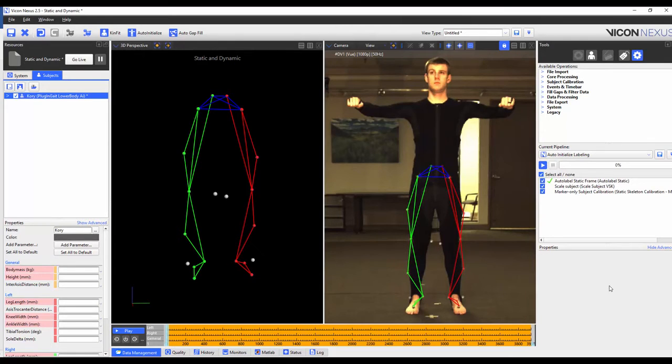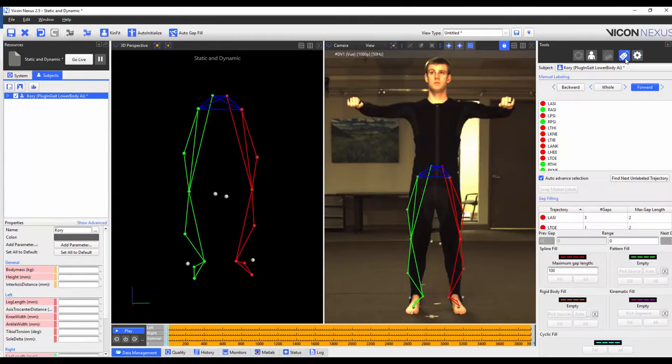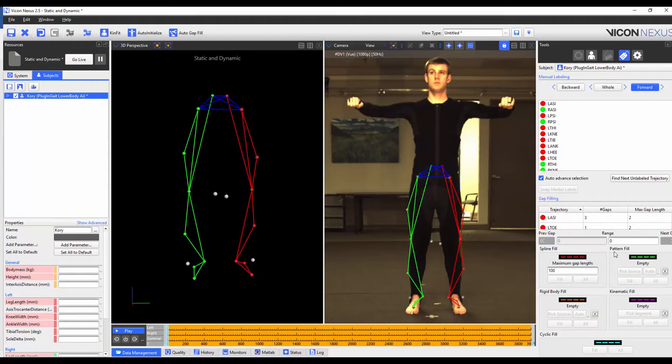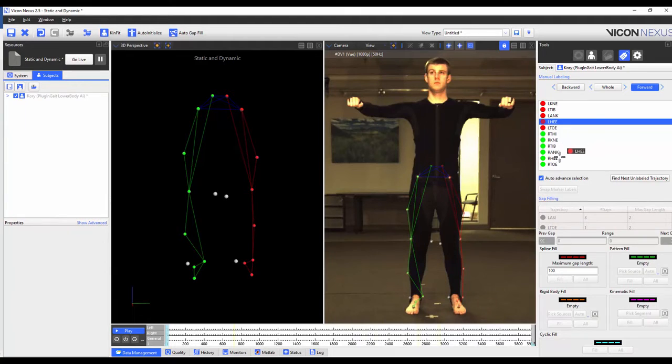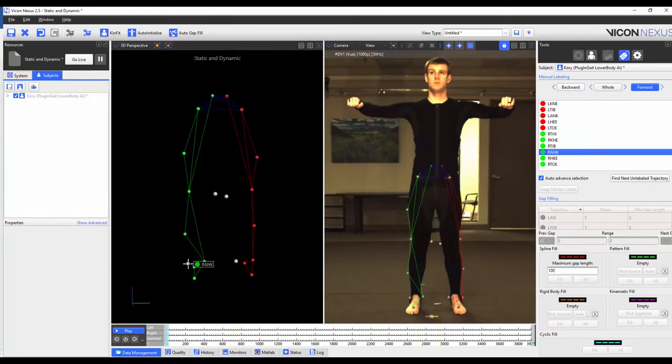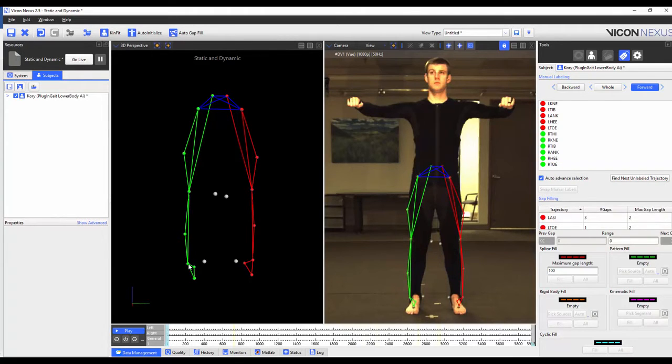I can already tell that my ankle markers have not been labeled correctly. To fix this I'm going to navigate to the tools pane label editor list and label the ankle markers correctly. Alternatively you can manually label the first frame.